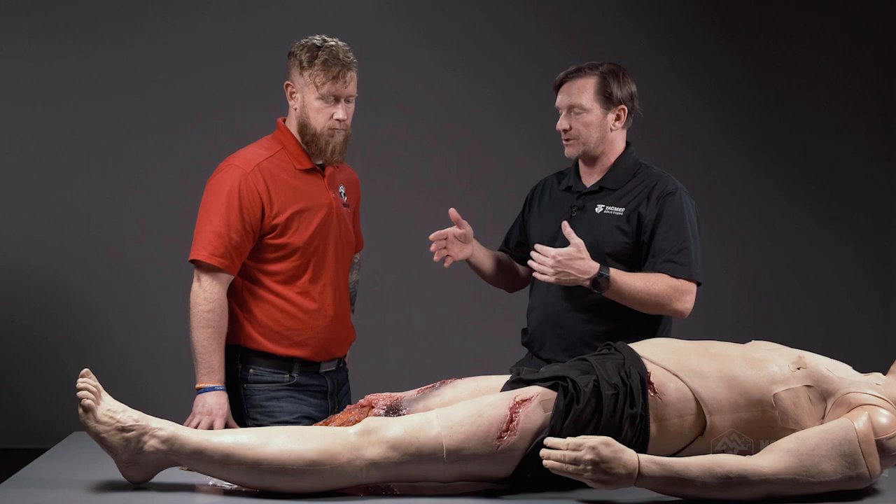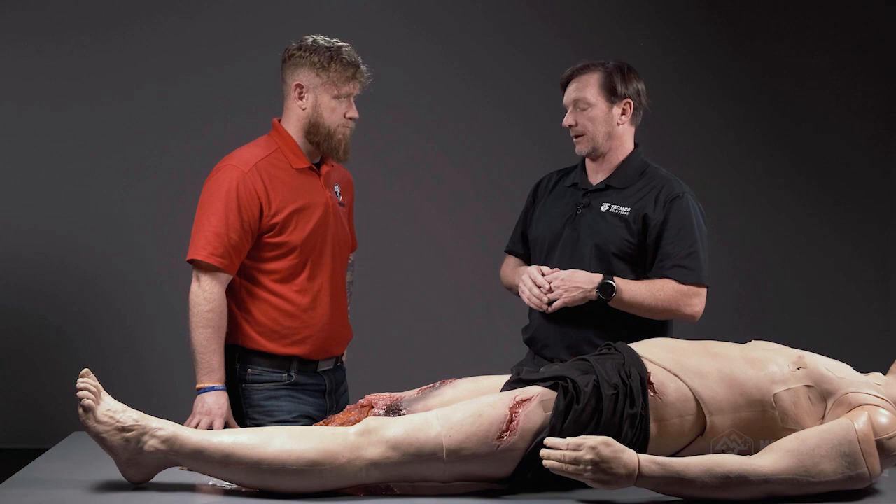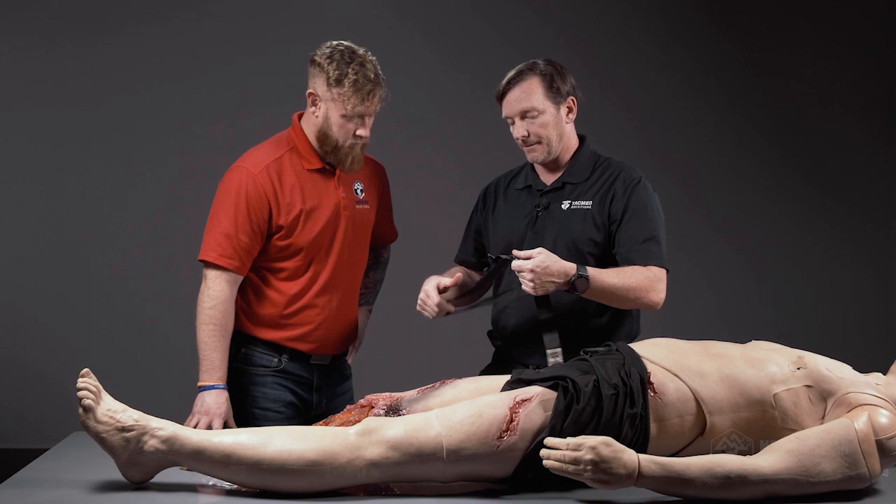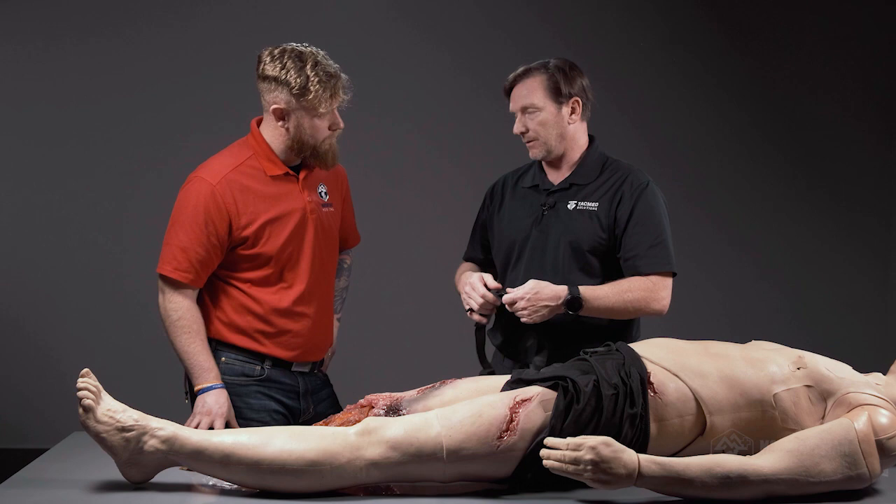Later on, when things slow down and we have a better idea, we go two to three or two to four inches above the wound, depending on your sources, and put the tourniquet on there. We'll probably do another training video on that, but for now we're going to use the soft tourniquet produced here at TacMed.